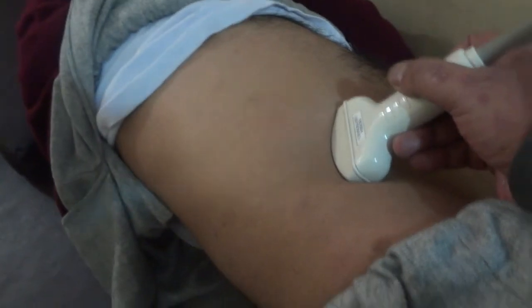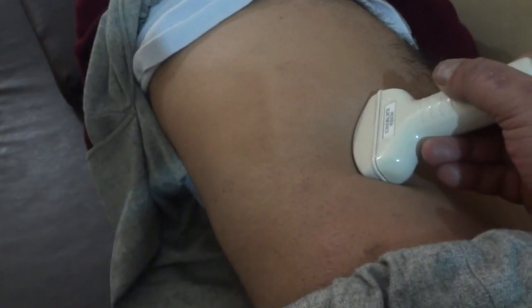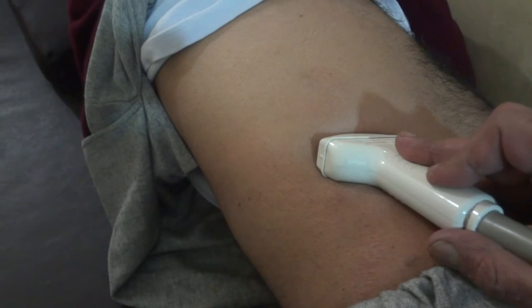Now, again to see the kidney and the liver parenchyma, you may have to place the probe under the subcostal region with little pressure. Ask the patient to take a deep breath, and you will see kidney and liver both to compare the parenchymal echogenicity. So these are a few of the planes that we use. If I place the probe here and ask the patient to take a deep breath, I will see the gallbladder with the vein.